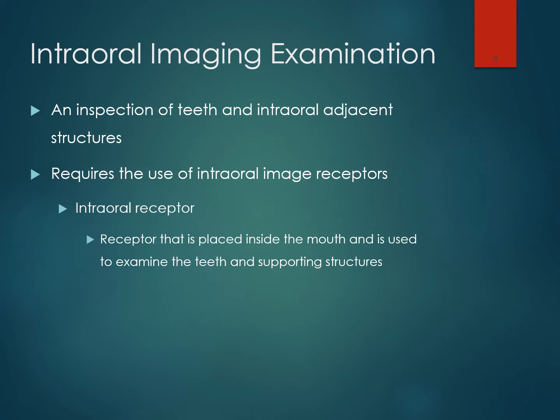It does require the use of an intraoral image receptor, either film or digital. And what makes it an intraoral receptor over extraoral is that we place it inside the mouth in order to capture those teeth and supporting structure images. Intraoral film and intraoral digital sensors are the most commonly used X-ray film and X-ray sensors. And so typically, you take more dental images in your lifetime than you will of other medical radiographs.